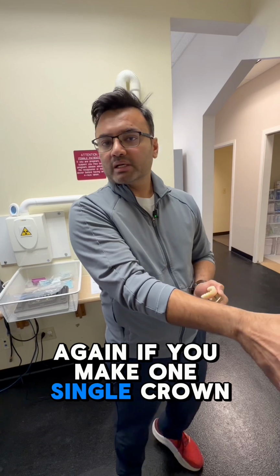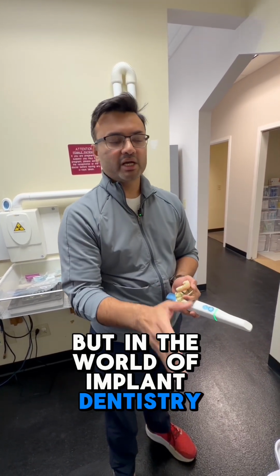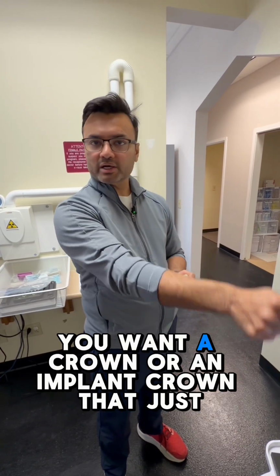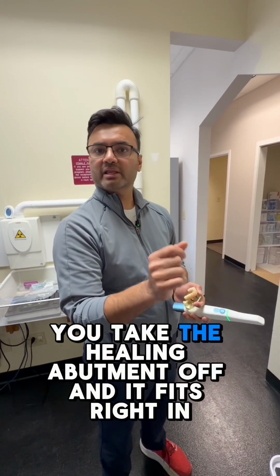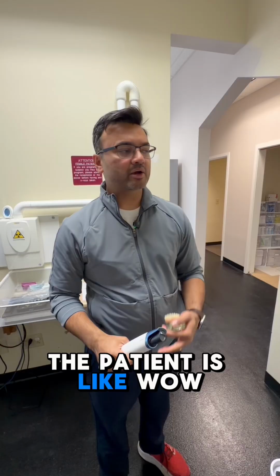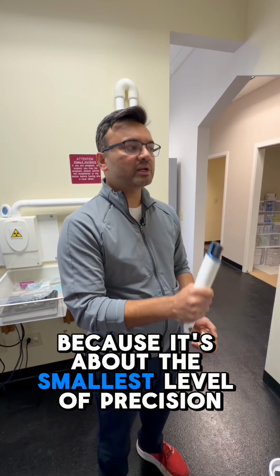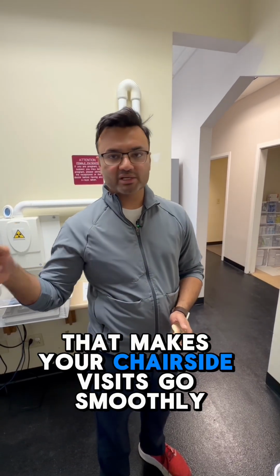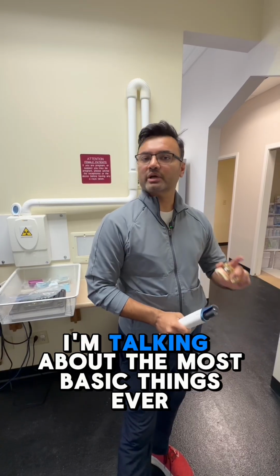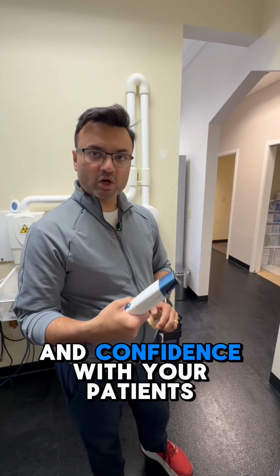Again, if you make one single crown, maybe this won't really affect you so much, but in the world of implant dentistry, every image count is extremely critical. You want an implant crown where you take the healing abutment off and it fits right in, zero adjustments. You are happy, and the patient is like, wow, this doc really knows what they're doing. Get your correct image count, because it's the smallest level of precision that makes your chairside visits go smoothly. The more you focus on the most basic things, the better chairside time and confidence you'll have with your patient.